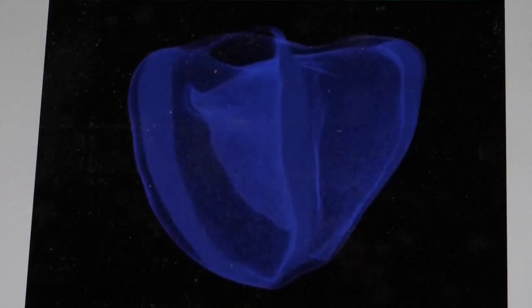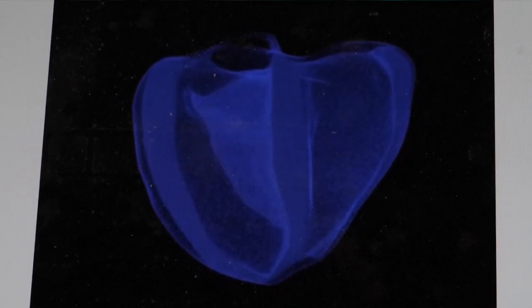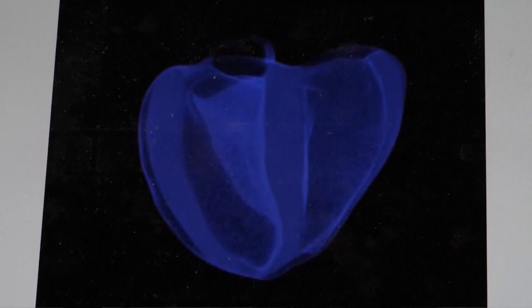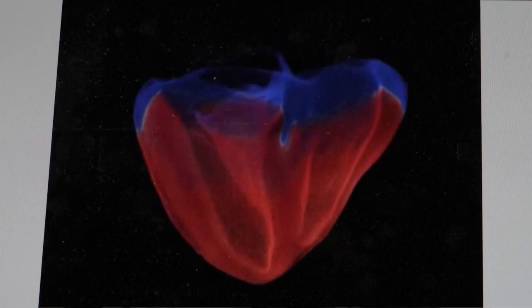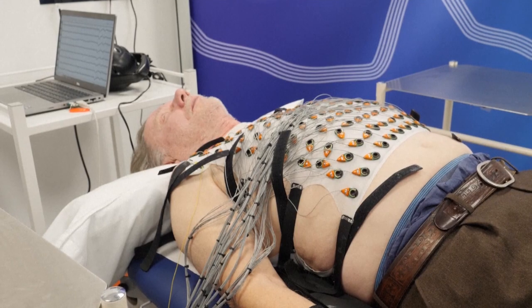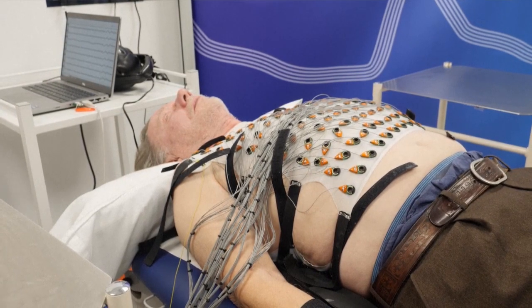And voila, you get this 3D image of the heart, where these red pulses show off the heart's electrical activity. It kind of looks like a screensaver, but it's really more of a lifesaver. Most of the catastrophic cardiac events that happen to patients and also in the general public are usually driven by sudden, dangerous heart rhythms, in other words, cardiac arrests, which sometimes happen in people who have diseased hearts, but sometimes it also catches us unprepared. It happens in people who have seemingly normal hearts.